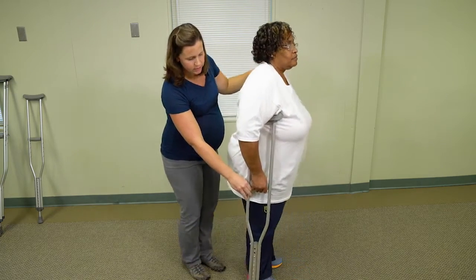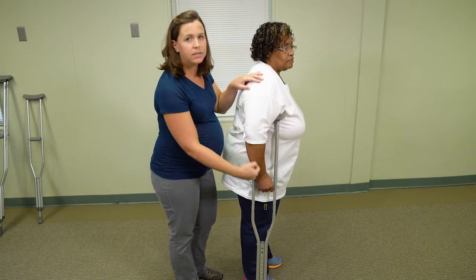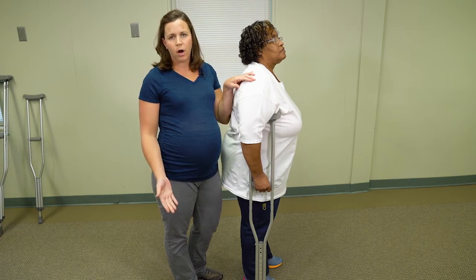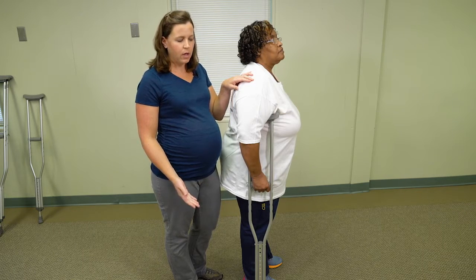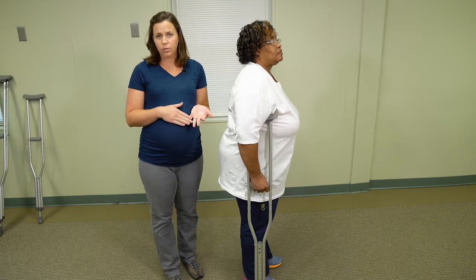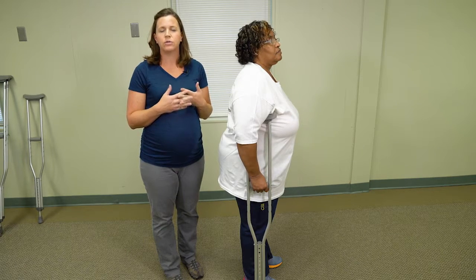Once the crutch is adjusted, there should be a little bit of a bend in the elbow. This will allow you to push through your arms when you're walking with the crutches later. You may have to adjust the crutches depending on what height of shoes you're wearing and things like that as you start to walk.